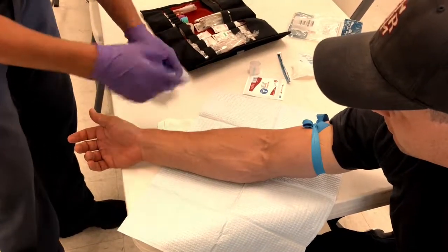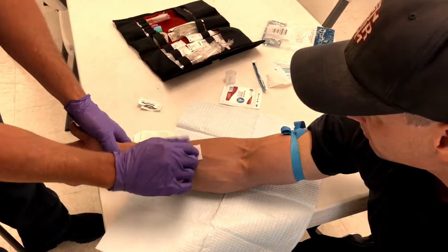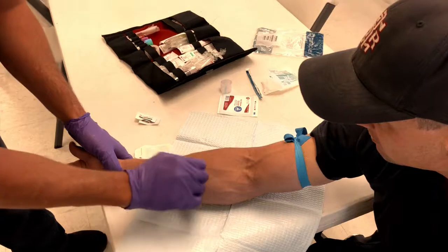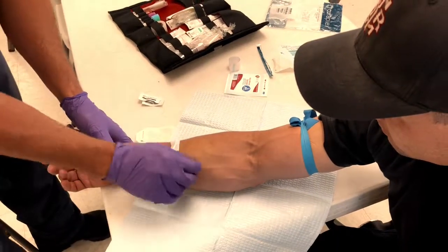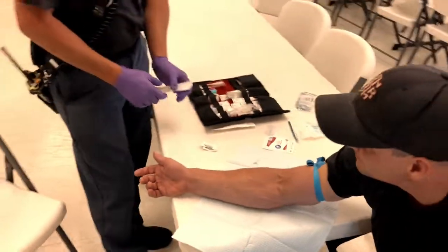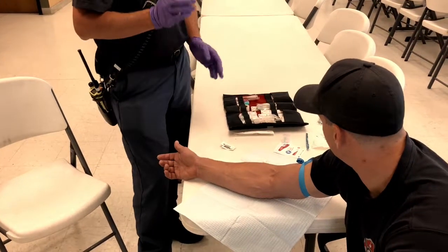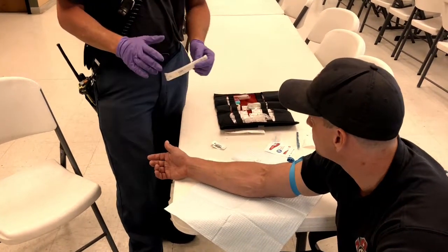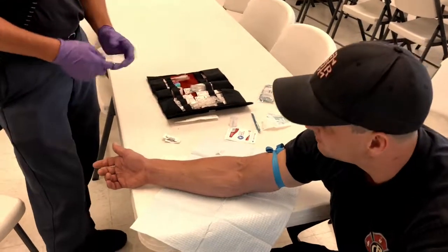Okay. Identified the site. We want to make the site clean. So, aseptic technique. Nice small circles and come out. So if we are planning on doing a blood draw on our patient at this time, we would set this up as well. For demonstration purposes, we're not going to do the blood draw on Adam. So again, still aseptic. We haven't contaminated it at all.